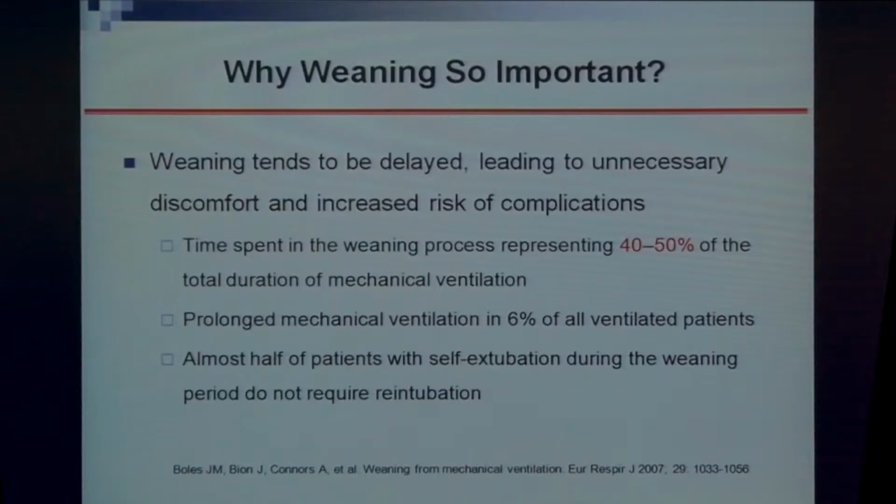Thanks for the introduction, and I'm glad to be here to share some data on neuroventilatory efficiency and weaning. Why is weaning so important to critically ill patients? We all know weaning tends to be delayed, and inappropriate weaning leads to unnecessary discomfort and increased risk of complications.